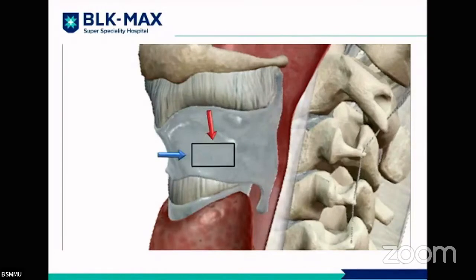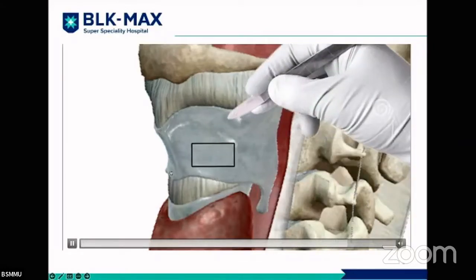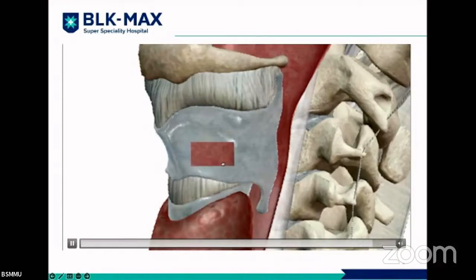Yeah. So I told you the midline we draw from thyroid notch, V of thyroid notch to lower border, and we make a triangle, a rectangular window at the level of vocal fold parallel to the lower border, like what I did yesterday, and you carve out.